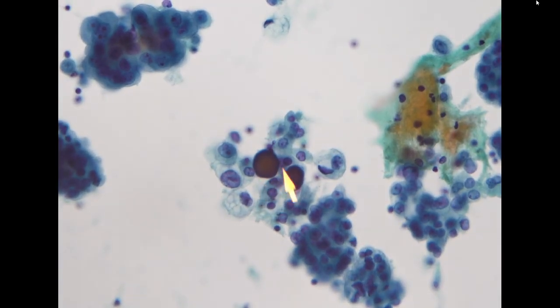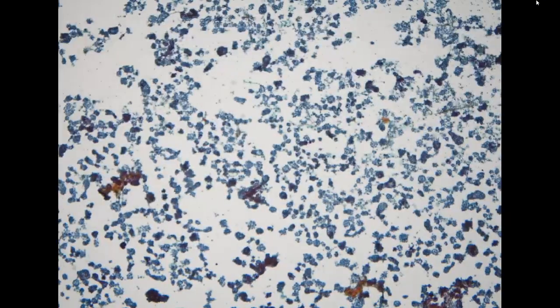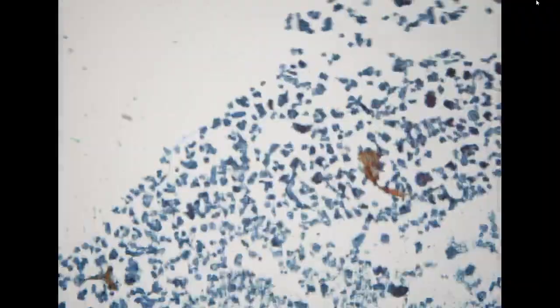So psammoma body can be present in primary lung adenocarcinoma. It's not very common, but you can definitely find it from time to time. So this is positive for adenocarcinoma. These are all confirmed, so we don't need to do a TTF1.